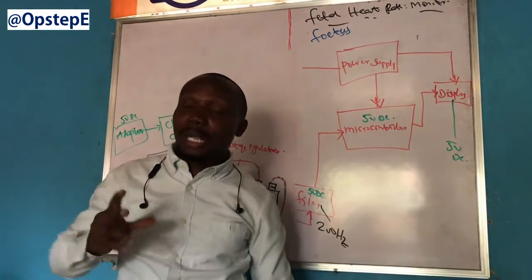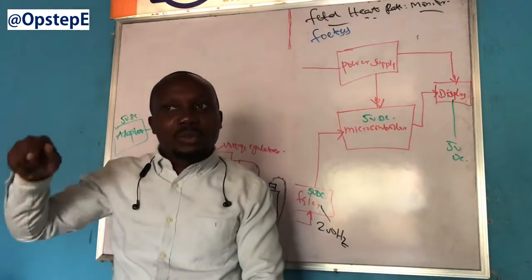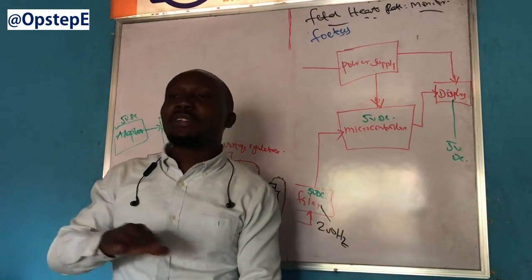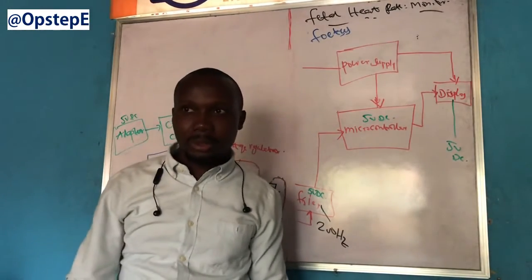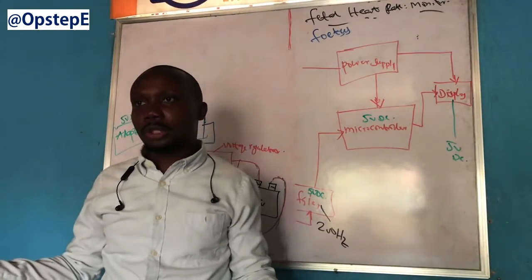The only way that voltage can be pushed up is if that battery was charged with a 12 volt supply first, so that it attains full charge. If you now bring in a 5 volt charger, what the 5 volt charger will just do is go to the top of the voltage so it can remain there. If you drain the battery, that charger will not charge the battery above its rated voltage.